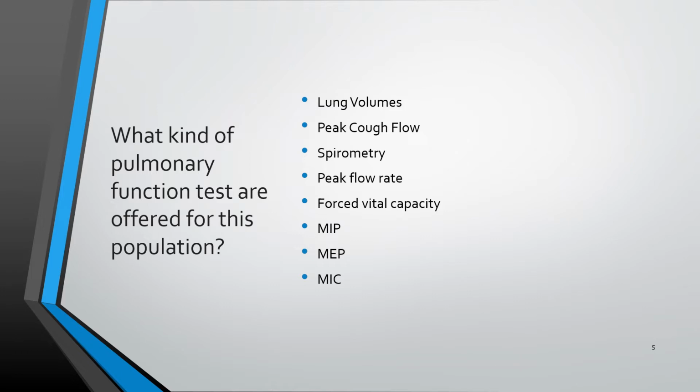And this is a component of expiratory muscle strength and chest wall and lung compliance. That is the problem with these particular patients. So measuring FEV1, forced vital capacity, and the FEV1 over FVC ratio is really important to understand.